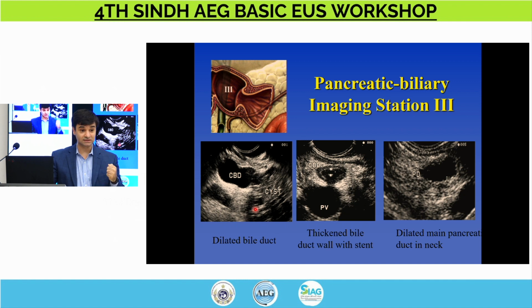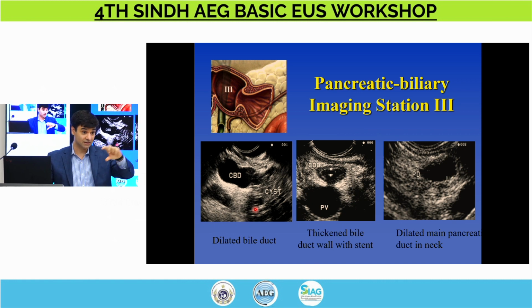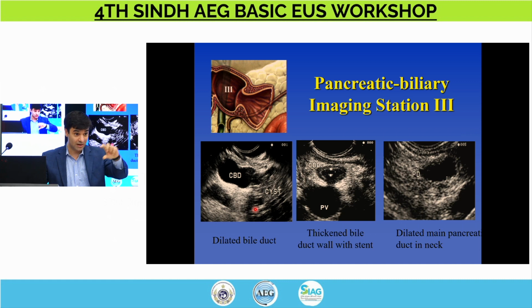So you stick, let's say, a cautery enhanced stent, hit the posterior wall of the bile duct and penetrate into the portal vein, then you have trouble if it's located in that problematic area of the duodenohepatic ligament. You're going to have bleeding intraperitoneally, and that's a problem. So focus on surrounding structures around your target. That is vitally important.